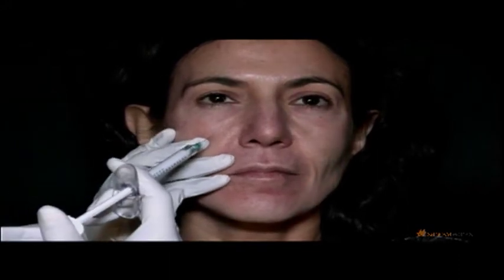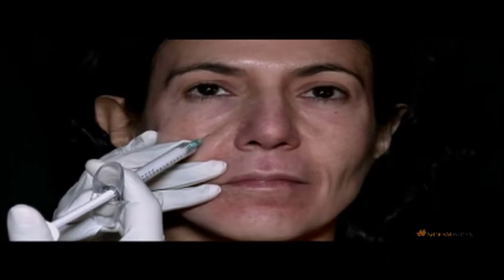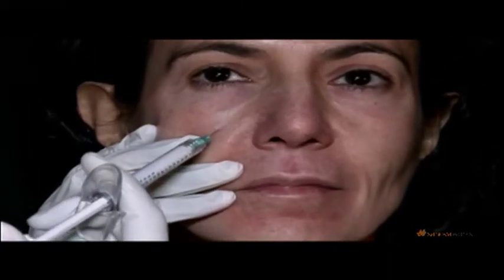We've cleaned Katya's face very thoroughly. This is extremely important, and you'll see that I'm going to be cleaning during the procedure. We're all very aware these days of biofilms, and we want to avoid introducing any bacteria. So I can view Katya obliquely and from above and below and discern an area that I can revolumize with my Radiesse. And I'm going to use exactly what I showed to you in the video, which is this microaliquoting technique. This has been mixed, final concentration of 0.3% lidocaine.